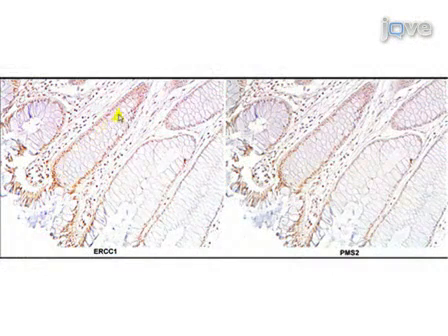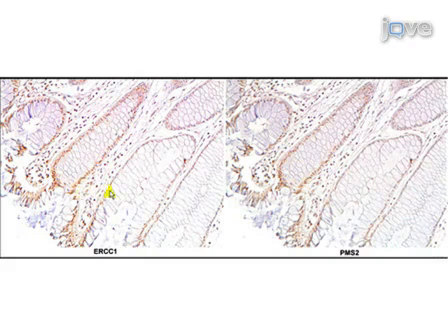You can notice the high expression of ERCC1 here. Similarly, the same crypt, stained for Pms2, also has high expression. These neighboring crypts do not exhibit high expression, shown here and here. Adjacent crypts, stained for Pms2, also do not show high expression here and here.